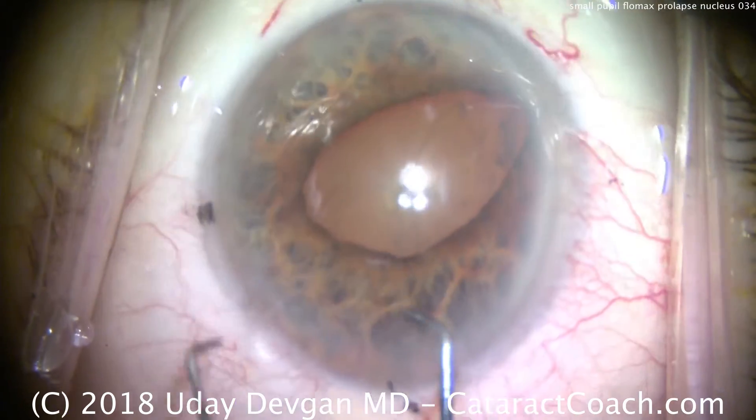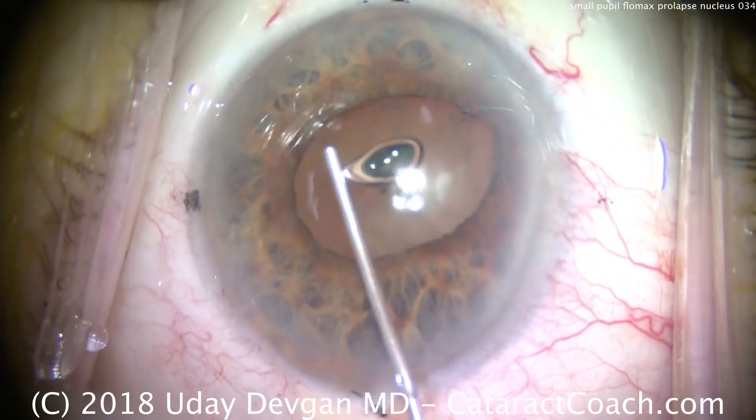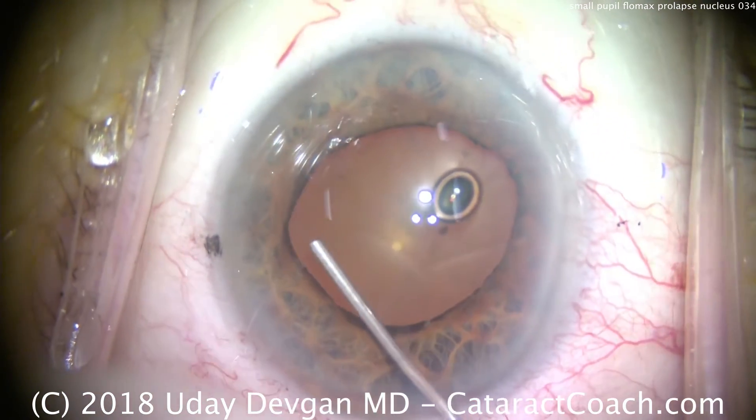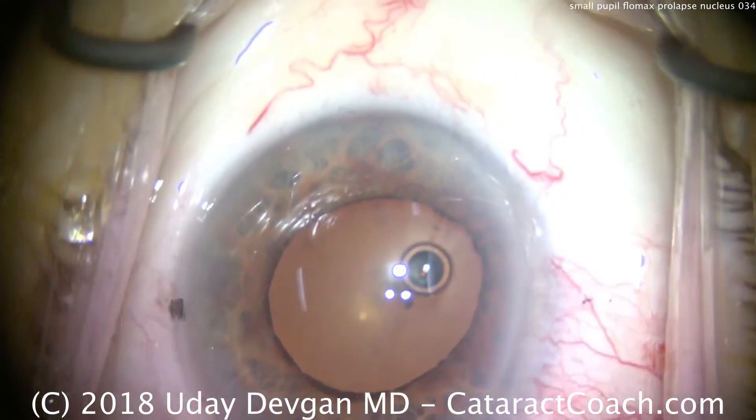Now, this patient is taking Flomax, which is Tamsulosin, for his prostatic issues to help him urinate. As we know, that affects the eye as well. More viscoelastic is used here to viscodilate.